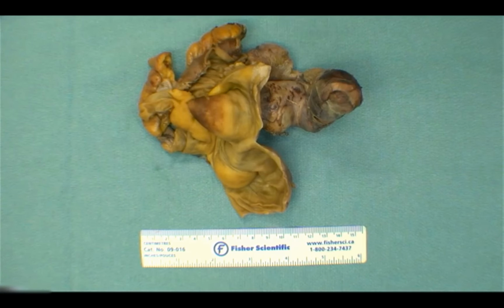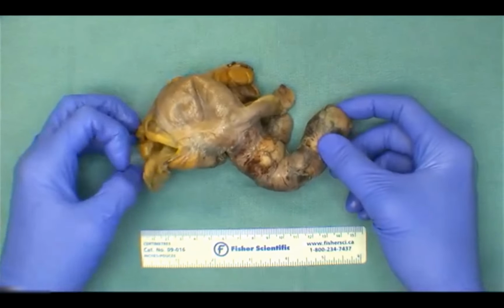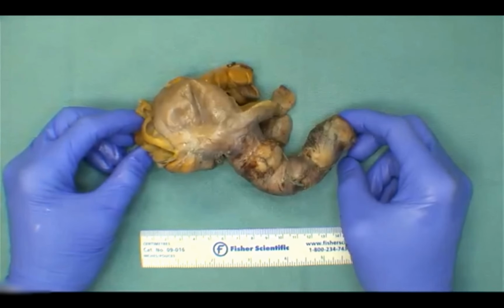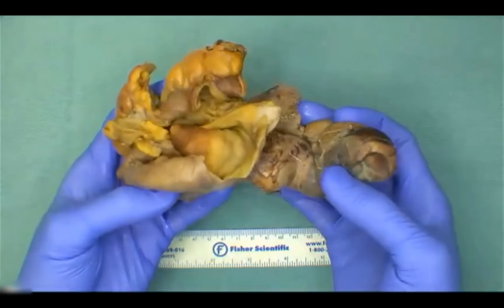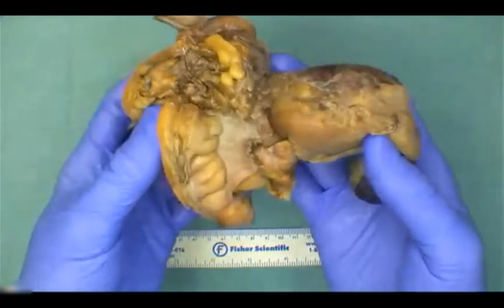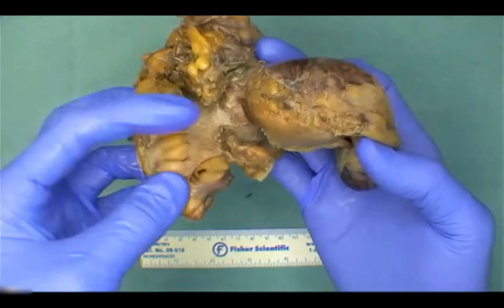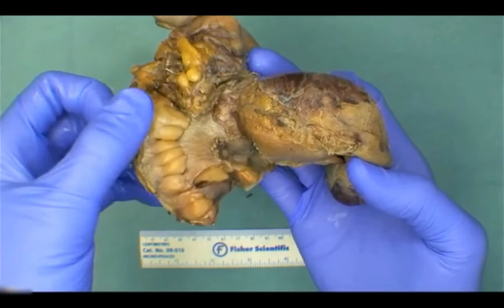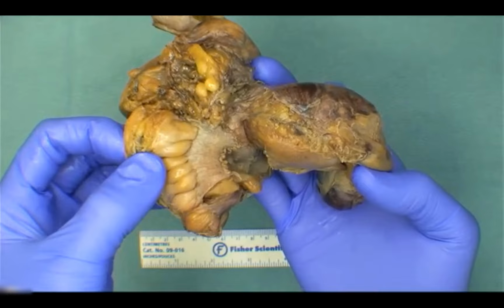So a bit of a spread in terms of what this could be, and I think that was the goal of being a little bit intentional so that we wouldn't make it so easy for our first question of the day. The majority of respondents did select the right answer in the sense that we are dealing with an appendix. If we look a little bit through our specimen here, just come back here. So I think maybe we saw some keen eyes before I showed the mucosa, perhaps honed in on the configuration of the fat here, consistent with small bowel mesentery. Maybe people thought that we were talking about small bowel, and we do have a piece of small bowel here.